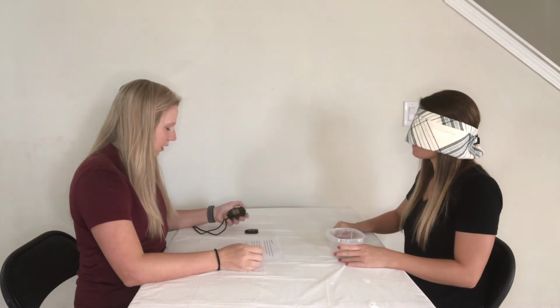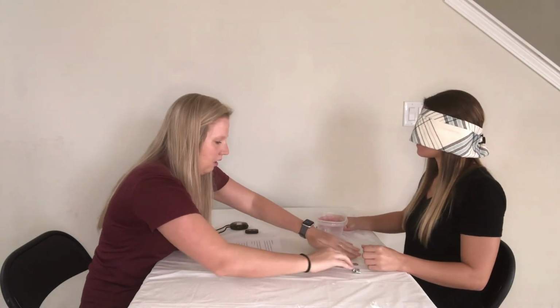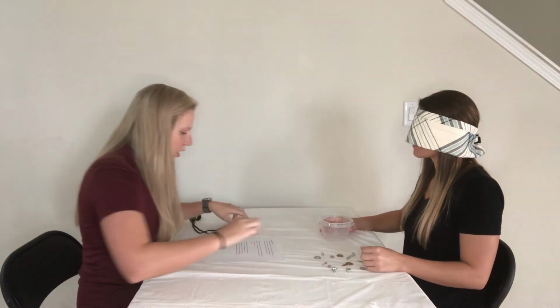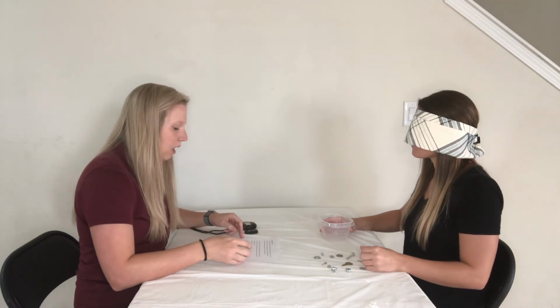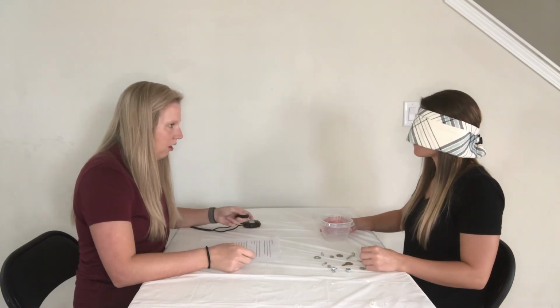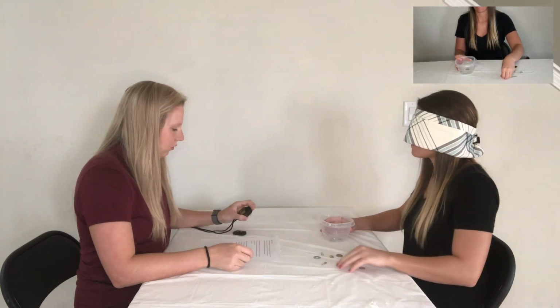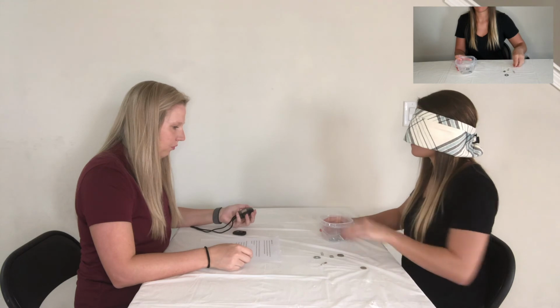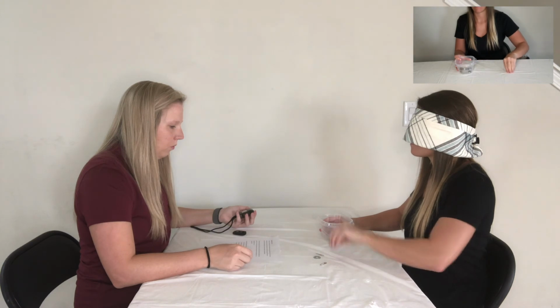Okay. Now we will test your left side. Here's the container. You will begin by picking up the items one at a time and placing them into the container as fast as possible. You are not allowed to slide the objects on the platform when picking them up. You may begin when I say go. Are you ready? Yes. Go. You have 3 items left.